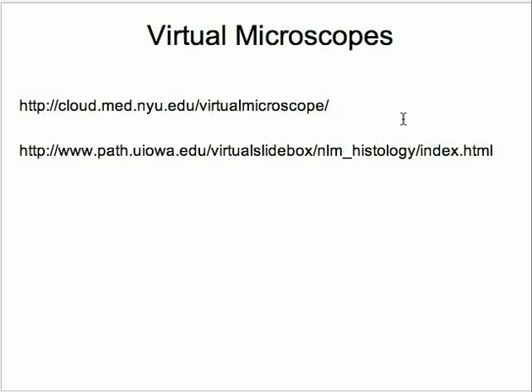So that about covers it for the virtual microscopes. What I'd like you to do over the next day or two is to play around with either or both of these virtual microscopes, test them against your broadband speed, and please email me if you're having difficulty using the microscopes. If they're remarkably slow, then you might let me know by email, and we'll see if there's some other mechanism that we can work out for you.